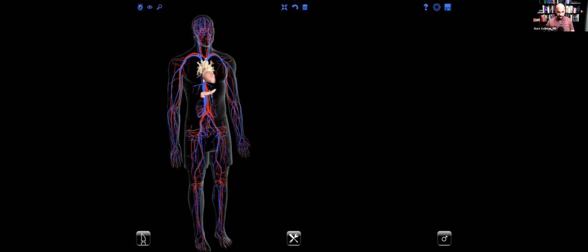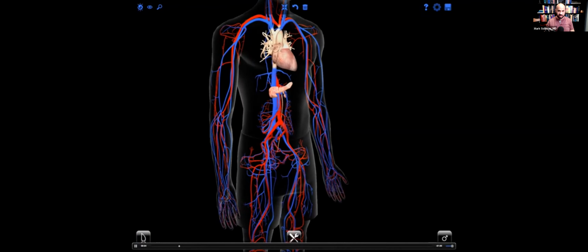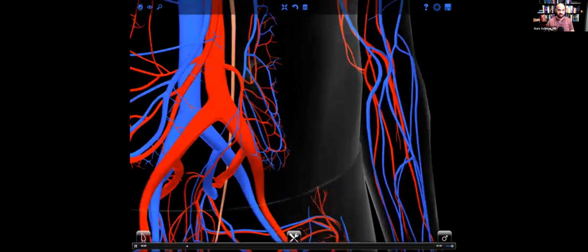Again, you guys are going to see this video when we talk about the anatomic relationships. I did this little video on my iPad. I'll run us through it real fast. And this video is going to show pancreas, IMA, IMV, and ureter. You're going to see the orientation here, and I'll pause it.